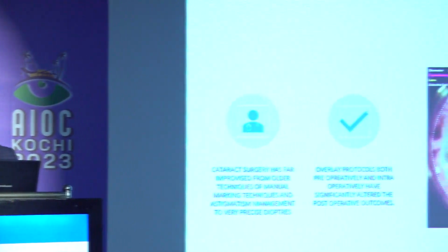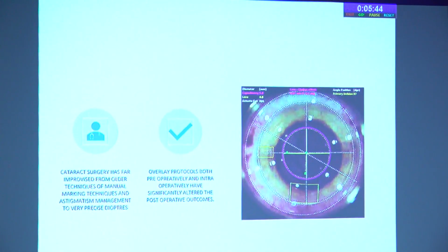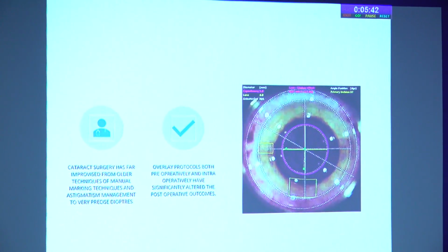Hi, morning. So I'm just going to brief you about the different intraoperative imaging techniques that we have today in our surgical armamentarium. As we know, the demands of our patients, especially in cataract surgery, are constantly increasing. This intraoperative imaging can take our accuracy and precision one step further and give you an edge when performing your cataract surgery. So essentially, what this does is it helps you plan your toric IOLs.